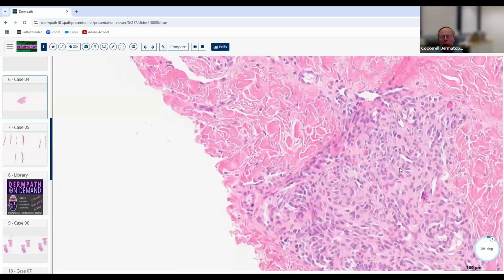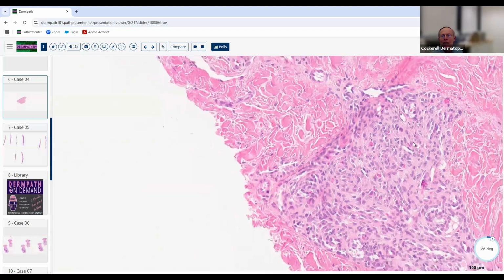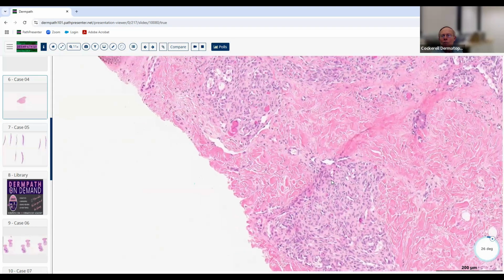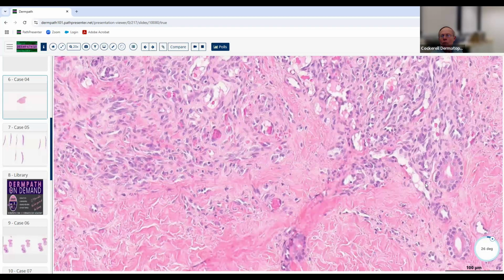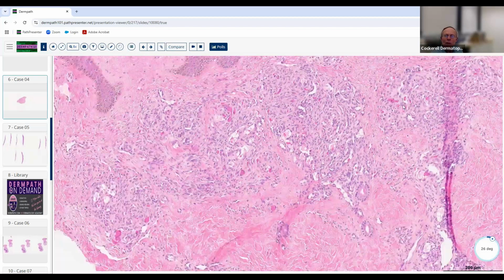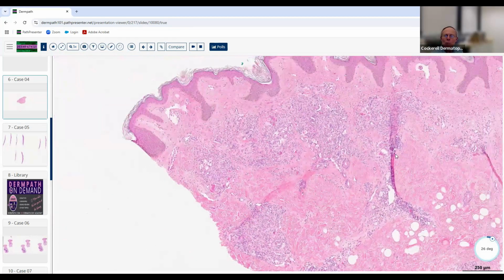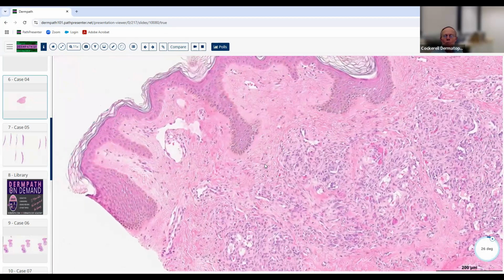And then the endothelial cells are large, they're coalescent. Some of these cells are quite pleomorphic and they're really hyperchromatic. Those are all features of an angiosarcoma. And so here's another example of one of those staghorn irregular blood vessels here. Now, on a scale of 1 to 10, this is probably about a 3 with regard to differentiation. It's not a poorly differentiated lesion. This is fairly well differentiated.